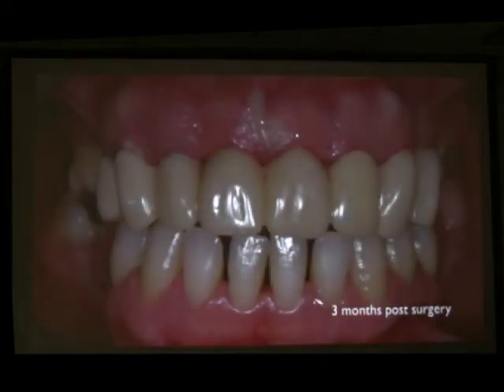Rigid, it has to be thick. This cannot fracture. If this fractures, we have a different loading in different zones, and some implants will have more load than other implants. So on the lingual, make sure it's a thick material. Don't make the teeth on the lingual or palatal have tooth shape. Make a thick structure. Patients will complain, but if this breaks, then you are in trouble depending on the stability of your implants.